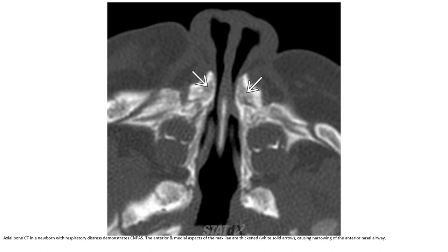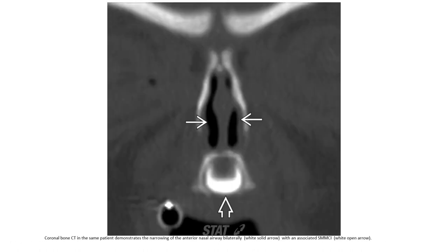Axial bone CT in a newborn with respiratory distress demonstrates congenital nasal pyriform aperture stenosis, with the anterior medial aspect of the maxilla causing narrowing of the anterior nasal airway. Coronal bone CT in the same patient demonstrates the narrowing of the anterior nasal airway.